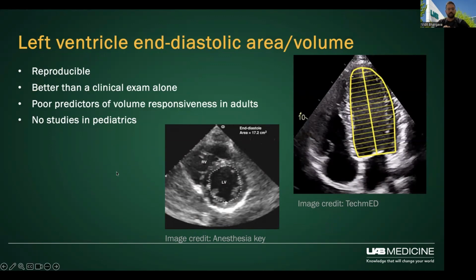So for left ventricular end diastolic area and volume, generally we try to get views of the LV either in parasternal long or in parasternal short axis. In apical, four-chamber view is also a really nice view to get a nice assessment of the end diastolic area and volume, and then you obtain a trace of these diameters, which could be used to predict either the area, or if you have views in more than one plane, then the volume.